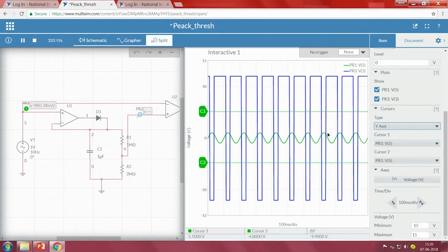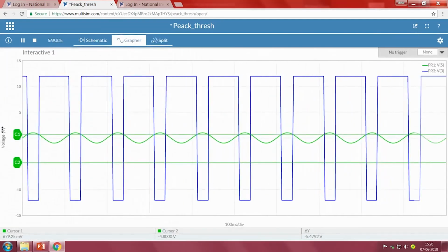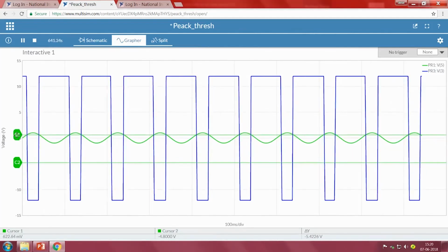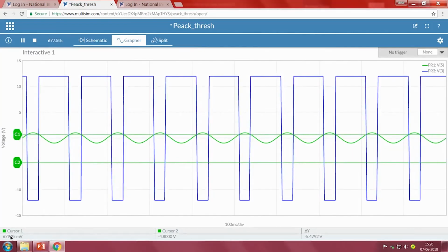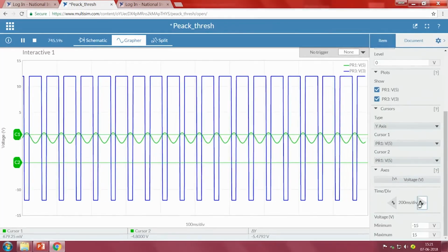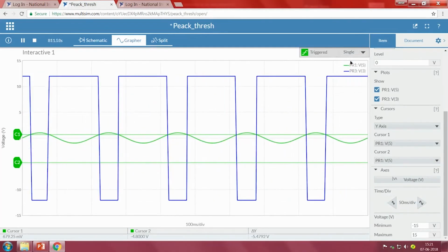I will take the y axis cursor and keep it somewhere around, if we observe the cursor value, it should be somewhere around 666 millivolt. Okay, somewhere around roughly 679, and let me zoom a little bit so that it is easy to understand for us. Make it as auto or single, yes.